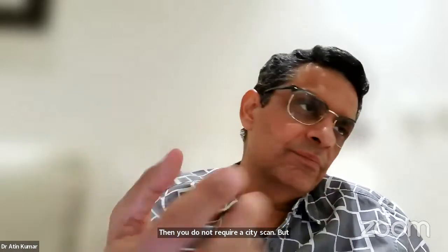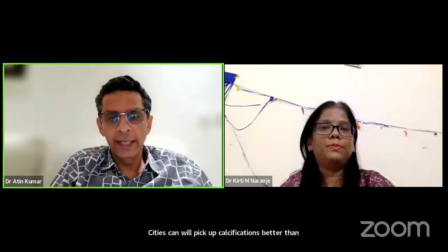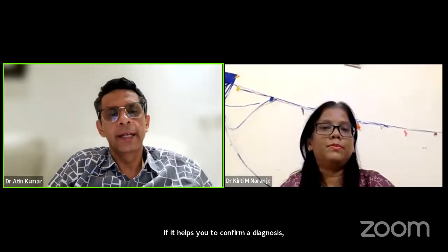But for subtle calcifications, which are not very bright, or if you do not have experience, then even MR, sorry, CT scan is the way to go. CT scan will pick up calcifications better than ultrasound, definitely, especially subtle calcifications. If it helps you to confirm a diagnosis, CT scan is definitely indicated.